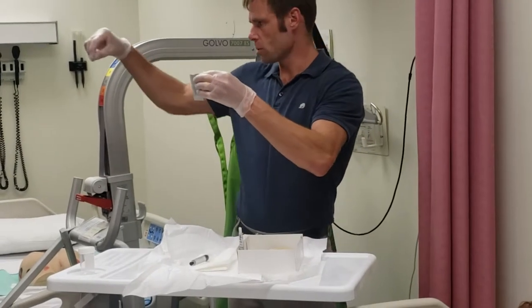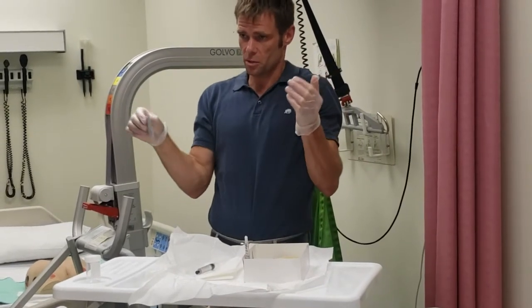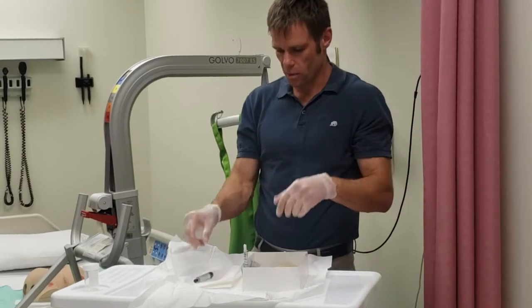A little arrow tells me where to tear. On a female we lubricate the catheter one to two inches — three is okay, but there's no real reason to go four. I'll lubricate before I go there.